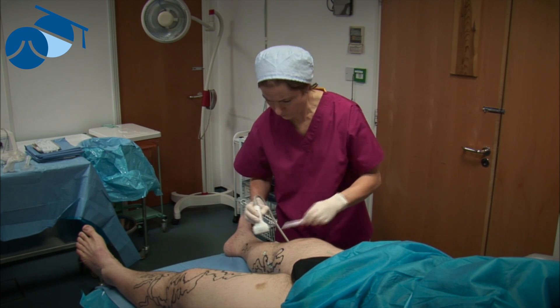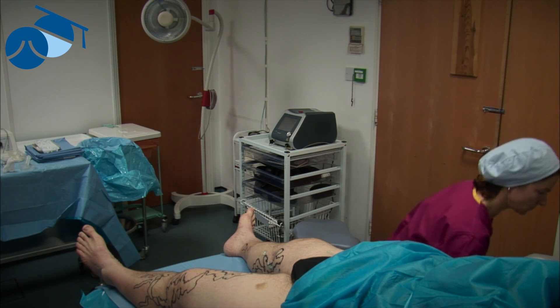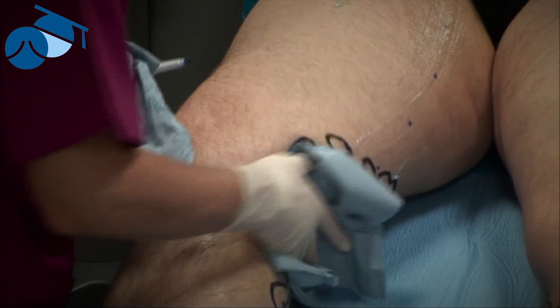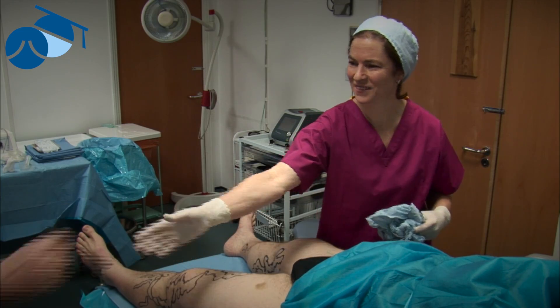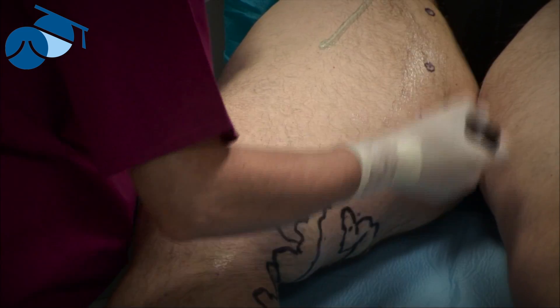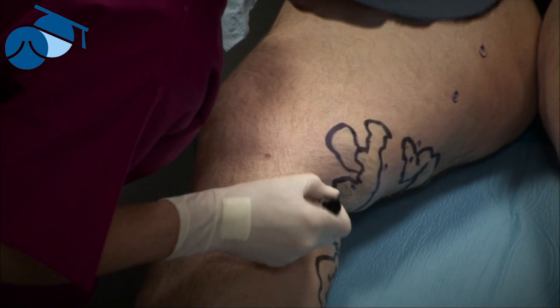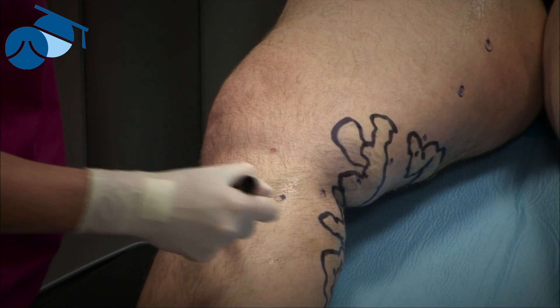In those superficial sections we have to decide what to do, as they're too superficial for laser or radiofrequency treatment. The vascular technologist is also choosing the best insertion point — in this case it's in the below-knee position. We can see that insertion below the knee is feasible and the device should be able to pass all the way up without any atrophic sections. We're now going over the points of tumescence and anesthesia to make sure they're well marked, and confirming where the insertion is planned.